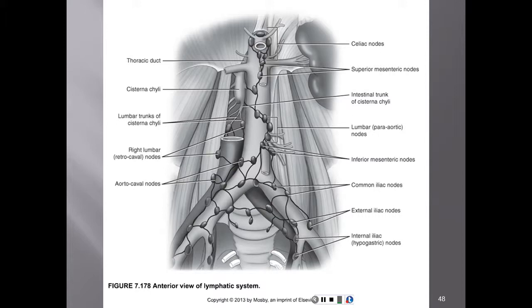Page 488, this is the lymphatic system. The lymph nodes that are closely adherent to the vessels themselves can identify pathology early if they are indeed enlarged. Many lymph nodes exist within the abdominal cavity. Abdominal lymph nodes occur in chains along the main branches of the arteries of the intestine and abdominal aorta. Most abdominal lymph nodes appear as small, oblong, soft tissue masses oriented parallel to their accompanying vessel.